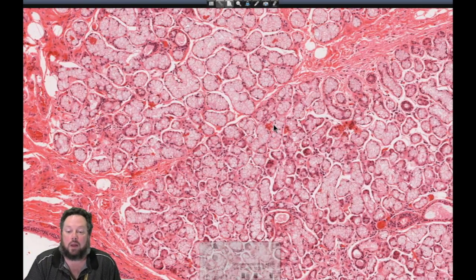So I talk about the decision trees, deciding whether you're looking at an entirely serous gland or a mix of mucus and serous, and therefore the composition of those, and then actually applying that decision tree as well. So I highly recommend that you check out the 3-minute histology videos on the salivary glands and the decision trees there, to help you make your own decision trees and work out what you're looking at.